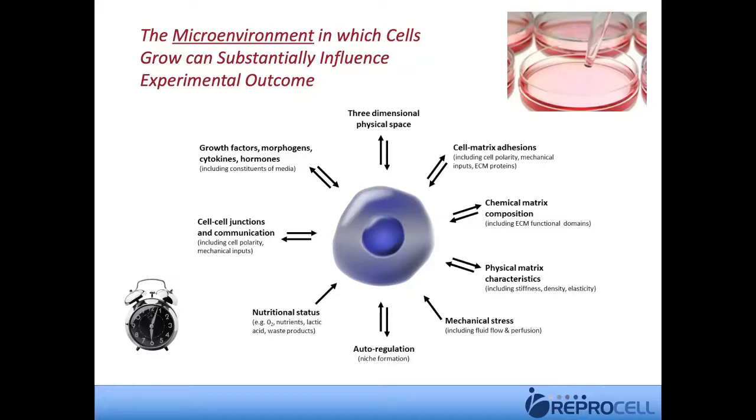So things like the nutritional status of the media, what you add to the media, the fact that you can introduce morphogens and hormones, the cell matrix adhesions and the extracellular matrix components, so coatings of plastic, for example, the connections between cells and their signals, mechanical stress, and importantly, the three-dimensional physical space.